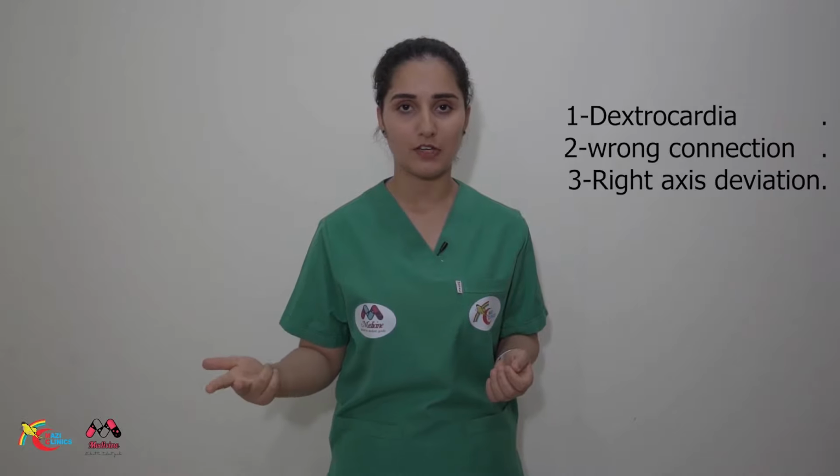If the P wave is negative, this could mean either dextrocardia, wrong connection, or right axis deviation. If it is dextrocardia, then when you look at the precordial leads, you will see that the QRS progression is not normal. If it is wrong connection, you will see that the QRS progression is normal on the precordial leads.